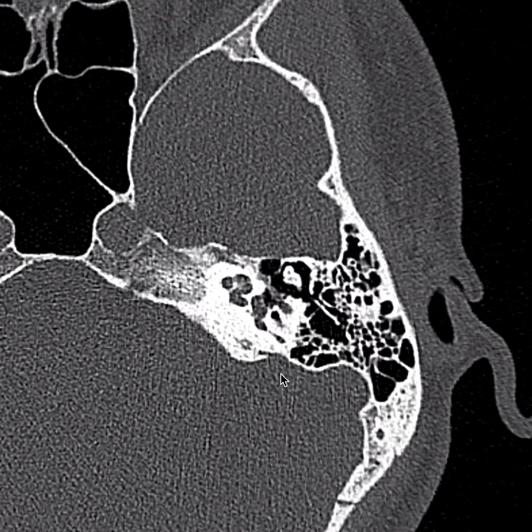Now let's also look right here at this opening in the petrous bone called the vestibular aqueduct. It opens here to the operculum. If this measures greater than 2 millimeters, it represents an enlarged vestibular aqueduct, which can be seen in sensorineural hearing loss. Additionally, if a midpoint between here and the vestibule or posterior area of the vestibule or common crus measures greater than 1 millimeter, so about in this area, then that would also be an indication of possible sensorineural hearing loss related to an enlarged vestibular aqueduct.